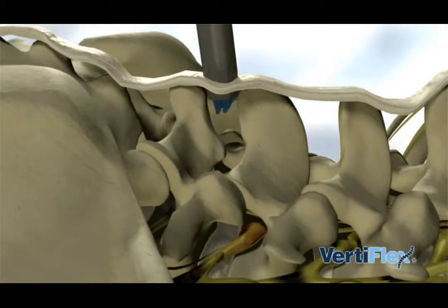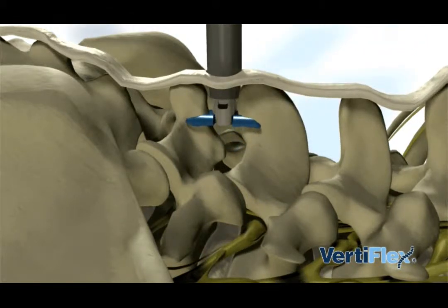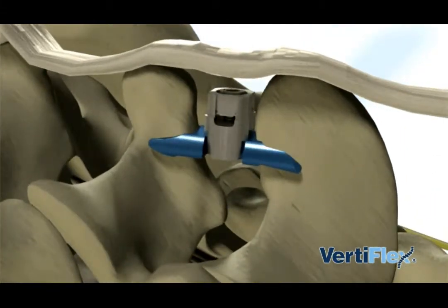No bone and only minimal soft tissue are removed during this procedure. Once implanted, the device can act as a means of support to open the passageways through which the nerve roots travel from your lower spine to your legs.